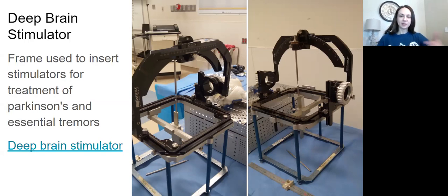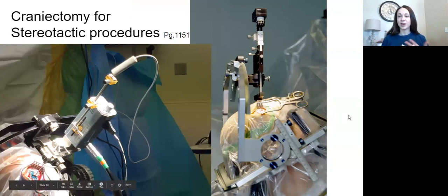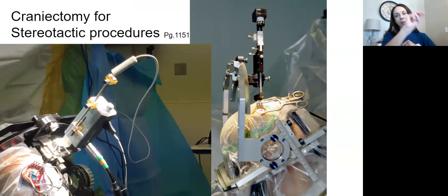So the moment they get this brain stimulator into the brain in the right spot, they have your patient doing different tests, and you can see this on the video. They might have them draw a circle on a piece of paper. They might have them open and close their hands, always have them touch their nose and then back out. Things for depth perception, hand motor coordination. So you could see somebody with severe Parkinson's and they go like this and they can't find their nose. They're shaking so bad. Or they're shaking and they're hitting their face. They can't touch their nose.